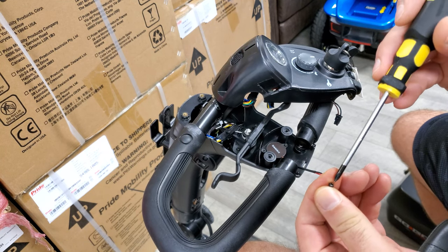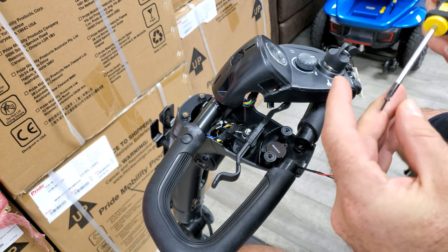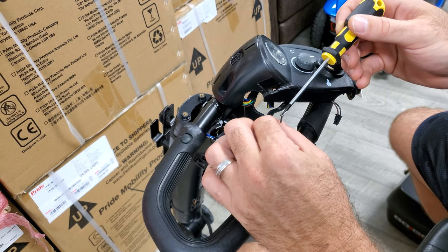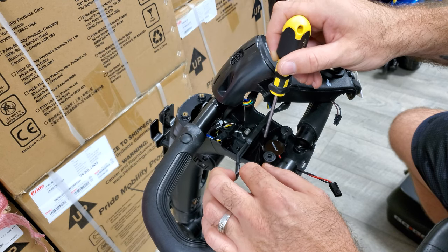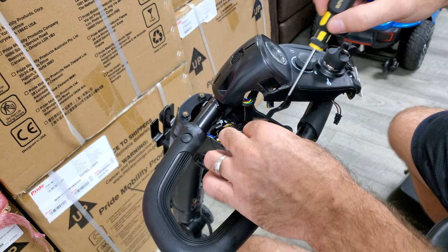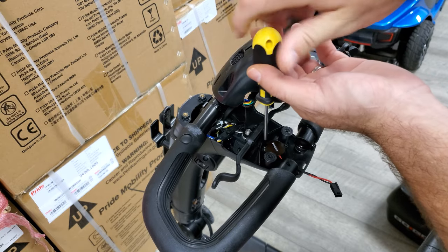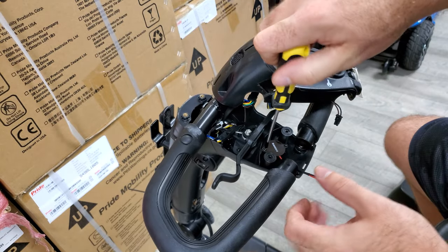I just want to grab the magnetic screwdriver — I lost the screw so I had to retrieve it. Let's go ahead and get that back into position.